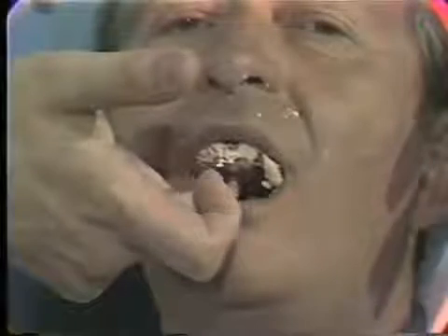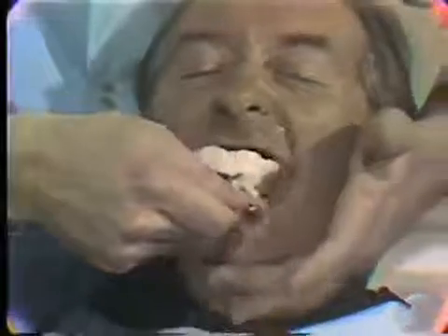After the material is set, the tray is removed. The patient's mouth is inspected to ensure that the airway is clear. The impression is next inspected to ensure that the landmarks and peripheries have been adequately recorded. The tuberosities and hamular notches should be identified bilaterally. The buccal and labial flanges should be identified bilaterally, and the buccal and labial frenuli should be visible. Often the fovea palatini are distinguishable at the posterior border. Material distal to the hamular notches and fovea can be removed.